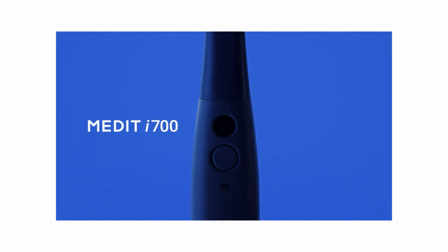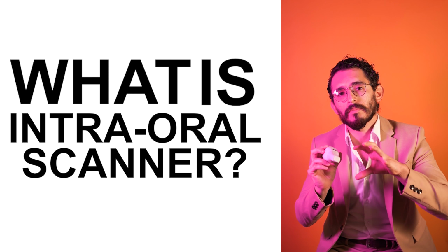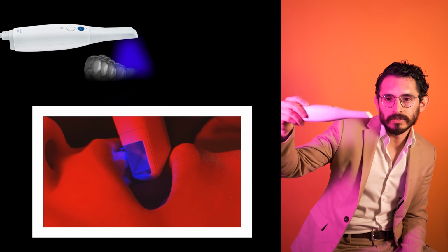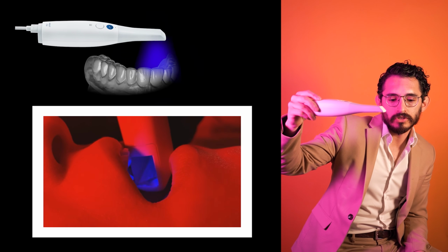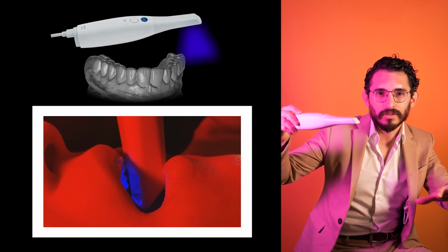Hello, I'm Dr. Diego Marquez, and today we're going to talk about the Medit i700, the new intraoral scanner that we now have with us. An intraoral scanner is a device used to pick up images from the mouth and reproducing them into a digital model. Think of it as how submarines use sonar to register the geographical structures of under the sea.